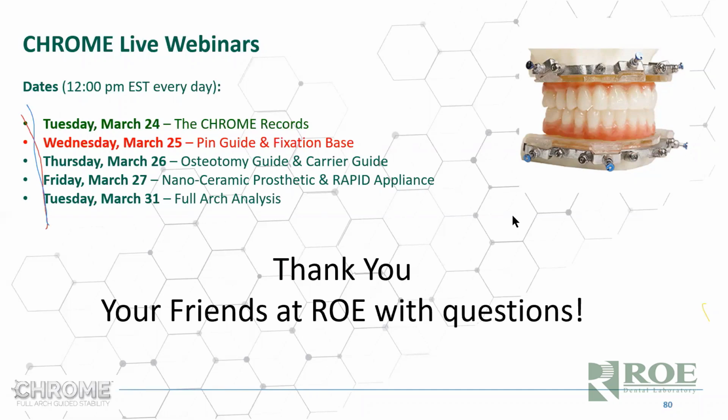Green mousse or blue mousse can be used instead. Yes, that's right. Either green or blue. If you have a soft liner and you don't want to remove it and do a hard reline, just like in whatever slide number that was, green or blue mousse. Yes.